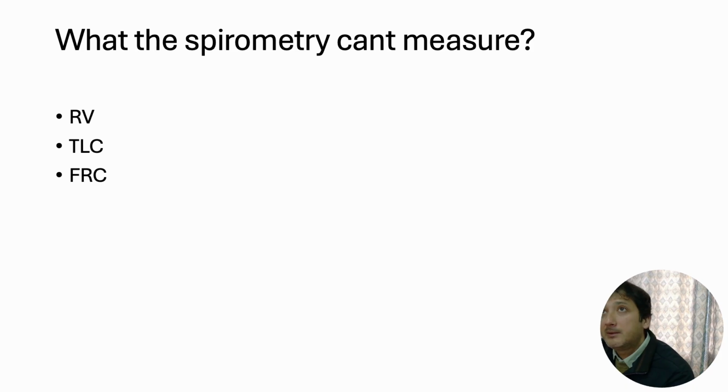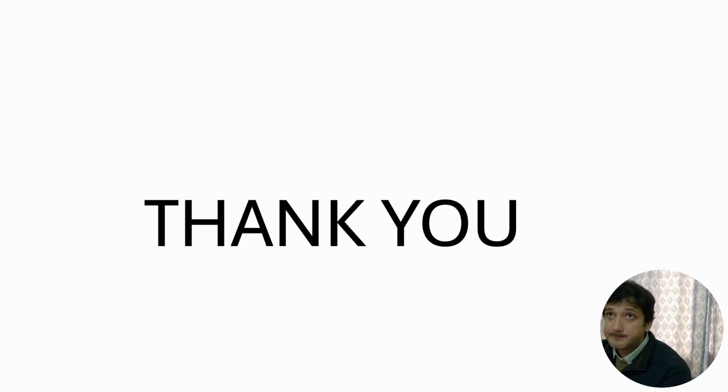So what can't spirometry measure? Spirometry can't measure residual volume, total lung capacity, and FRC. For this we have to use DLCO or plethysmography.